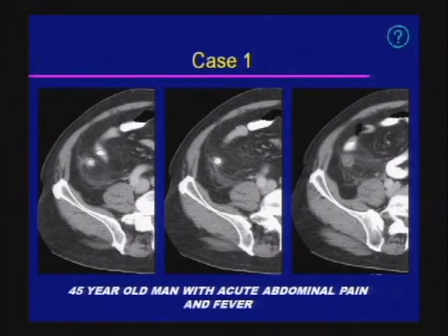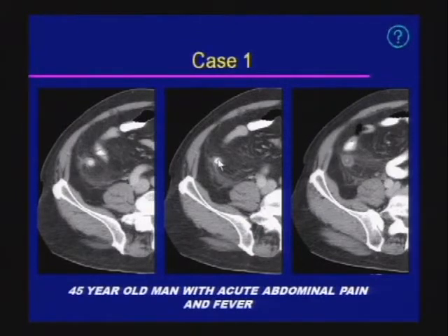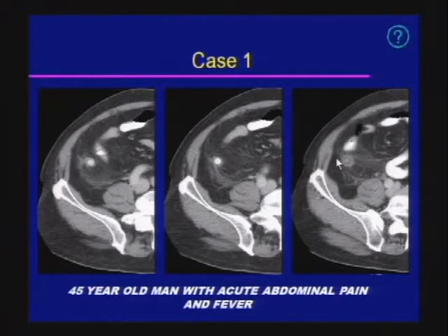Case one: a 45-year-old man with acute abdominal pain and fever. We see a large amount of stranding within the right lower quadrant. There's a high-density structure within the lumen of the appendix consistent with an appendicolith. We note stratification of the wall of the appendix with stranding. There's no significant free fluid in the pelvis and no evidence of abscess, so this is likely uncomplicated appendicitis.